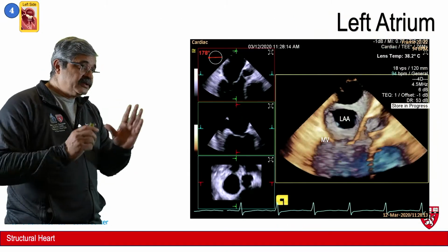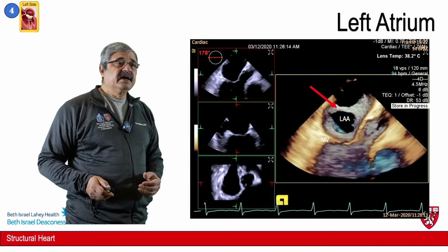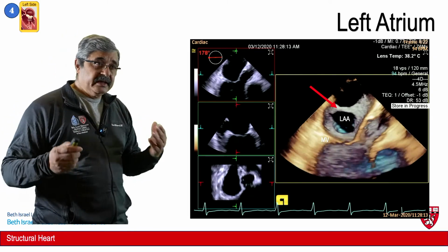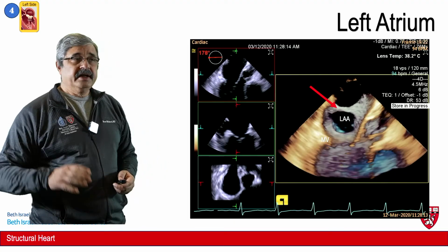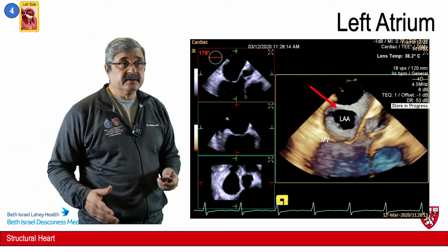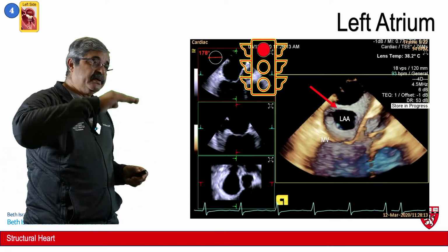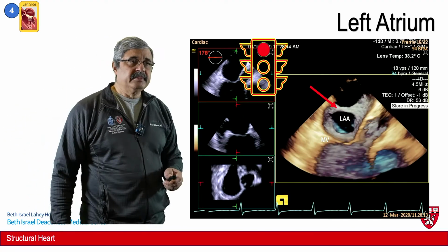So once you've crossed the interatrial septum, now we're on the left side of the heart. One of the most important things to recognize is the Coumadin ridge, or the ridge between the left atrial appendage and the left upper pulmonary vein. The left atrial appendage is one of the most anterior structures, the thinnest portion of the heart, and anything going into the left atrial appendage has a high likelihood of rupturing it and causing an effusion and pericardial tamponade. So this is one place that you do not want to go. Identify the Coumadin ridge and park every catheter that comes in into the left upper pulmonary vein.